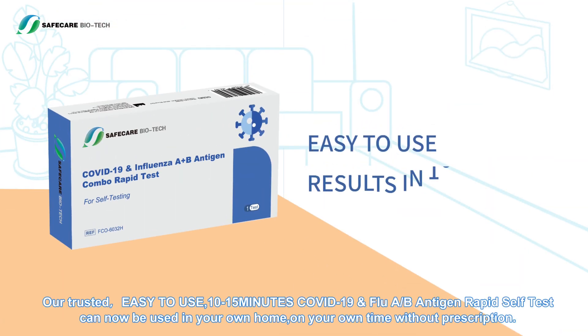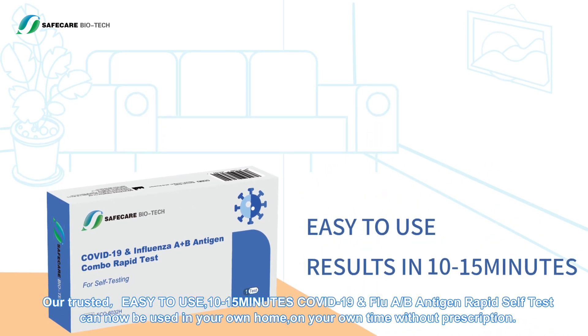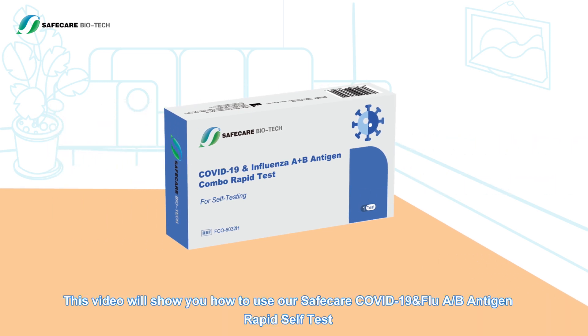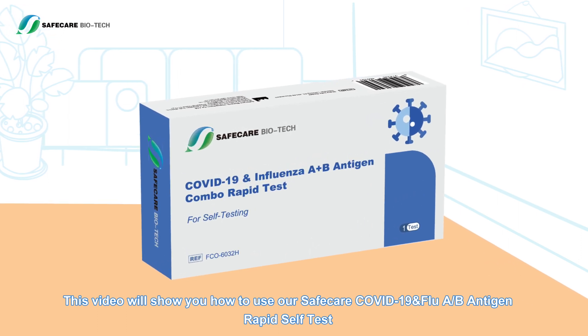Our trusted, easy-to-use 10 to 15 minute COVID-19 and Influenza A/B antigen rapid self-test can be used in your own home on your own time without a prescription. This video will show you how to use our COVID-19 and Influenza A/B antigen rapid self-test.